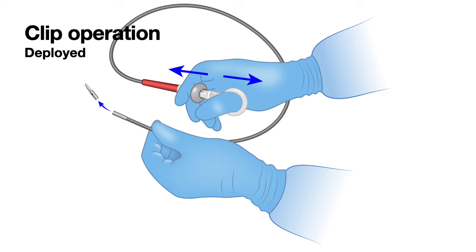And once the clip is closed and the bleeding stops, then he will say deploy, and that's the time you should deploy the clip. So one should not be in a hurry to close and deploy as one step. Instead, think about clip is open, the endoscopist goes to the vessel and says close, you wait. When he says deploy, then only deploy that clip.